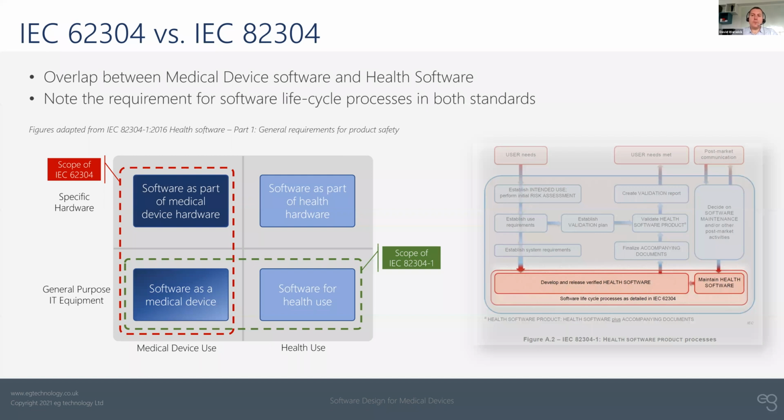And the other thing I will be stressing throughout this talk is that much of medical device software development can also be considered as good practice, good design and development practice for software and more broadly product development anyway. So software development for medical devices is not something to be scared about. It's just about following a well thought out, carefully designed process.